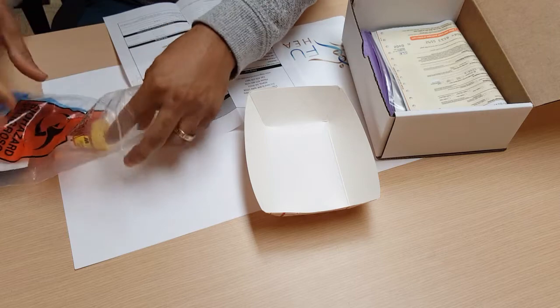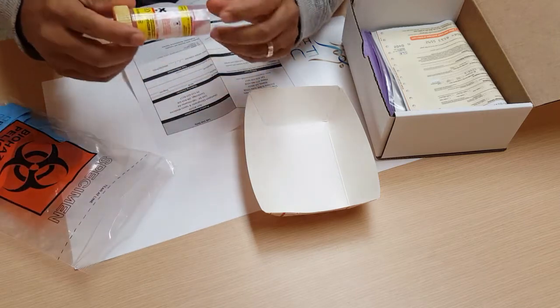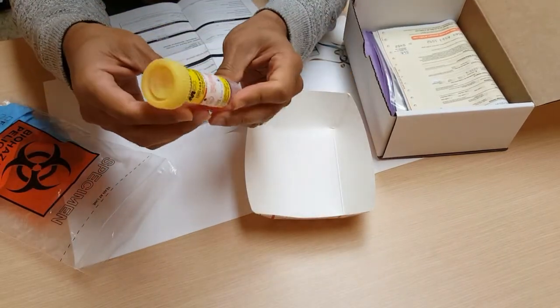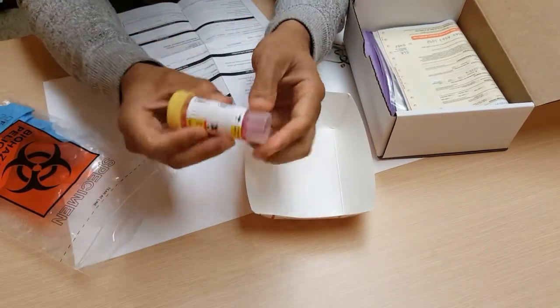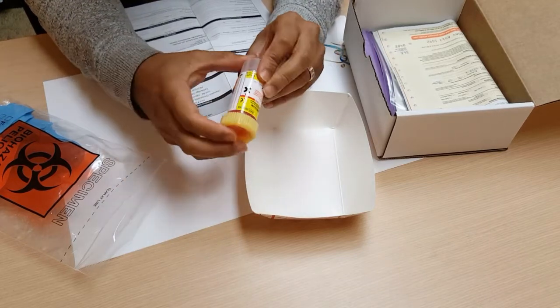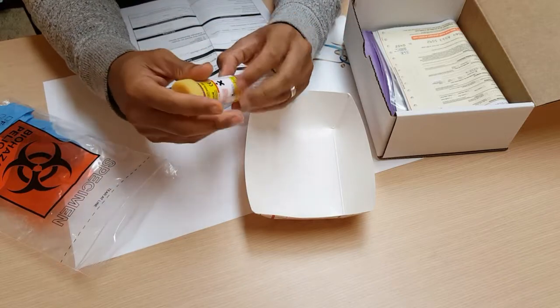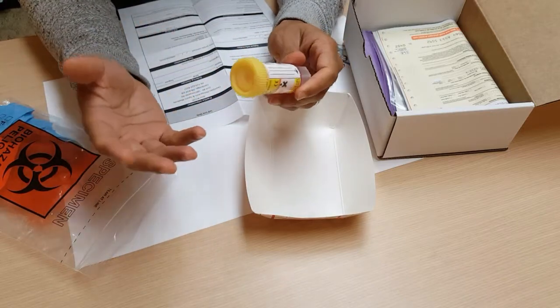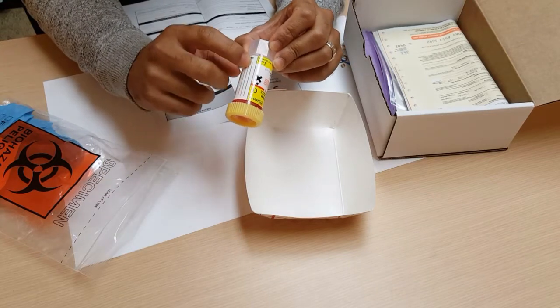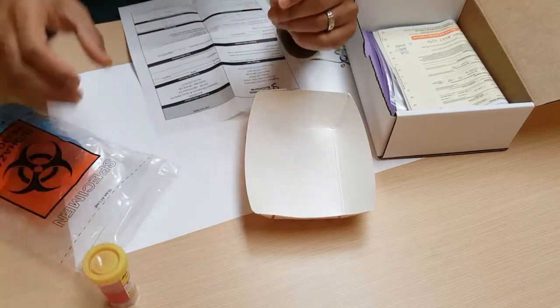As you get ready to collect your sample, the first thing to do is take out the yellow cap vial. On the side, there are lines where you should write your name and date of birth. If you forget to do this and it gets sent to the lab, it just gets tossed away because no one knows who it belongs to. So step number one: write your name and date of birth on the side of the vial, then set it aside.